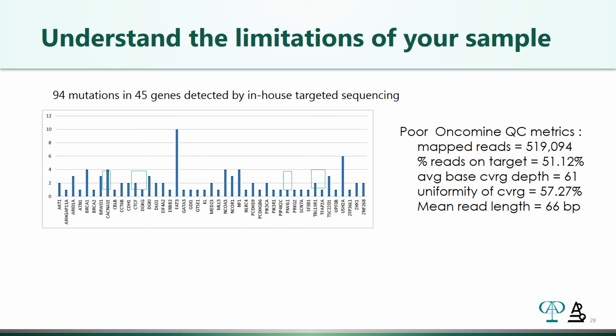And we've seen this repeatedly, that the quality of the samples really impacts the output of the reads. And so you need to be aware of everything from the very beginning of when you first get the sample in the lab to the very end where you're making the clinical calls, that each of the steps in the process along the way impacts how you're actually going to use these assays, how you're going to make the interpretations, and what you are going to say to the patient and the clinician when you use these assays in the clinical setting.